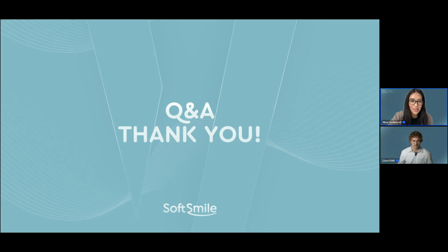Thanks, Dr. Galli. It's very useful to see how you approached that case and really just showcasing how vision has allowed you to deliver the best care, right, for your patient. So thank you so much. We do have some questions here.